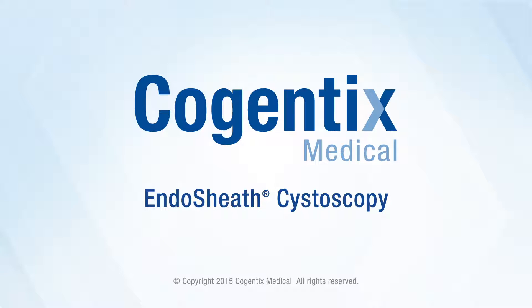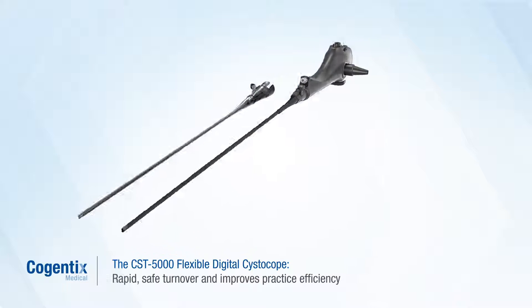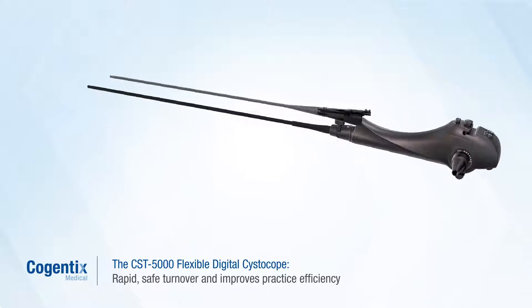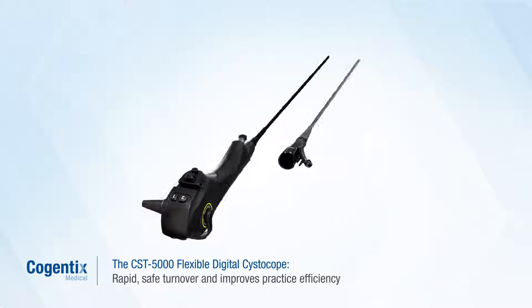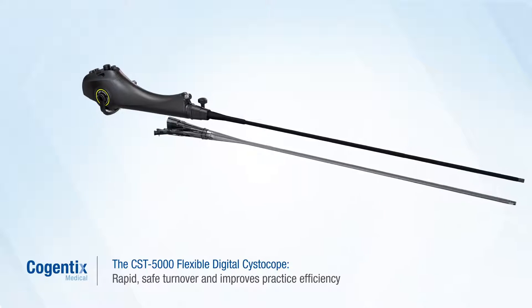Endosheath Cystoscopy from Cogentix Medical — an always ready, always sterile solution for you and your patients. The integrated Endosheath Cystoscopy System delivers rapid, safe turnover between procedures without increasing capital investment, for improved practice efficiency and profitability.